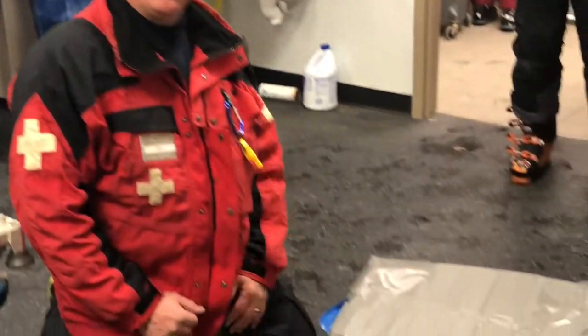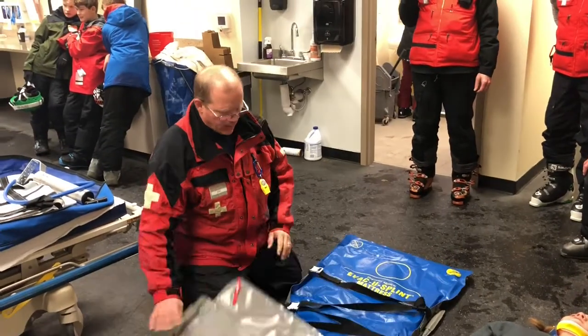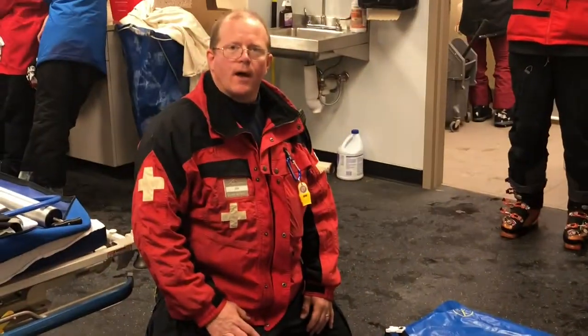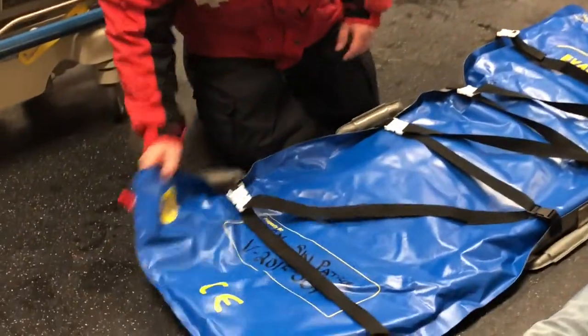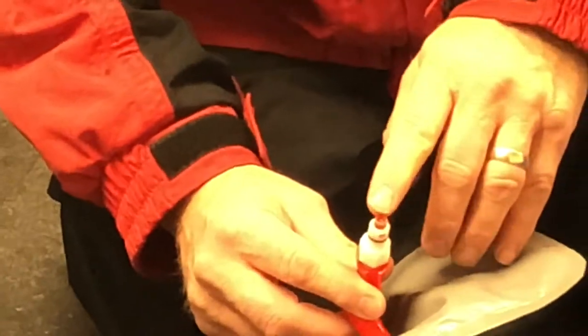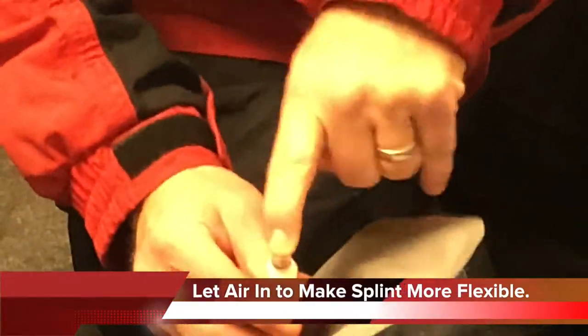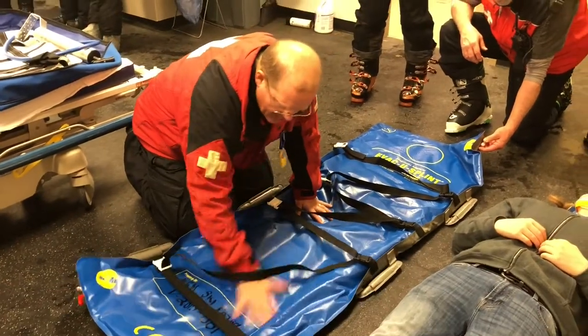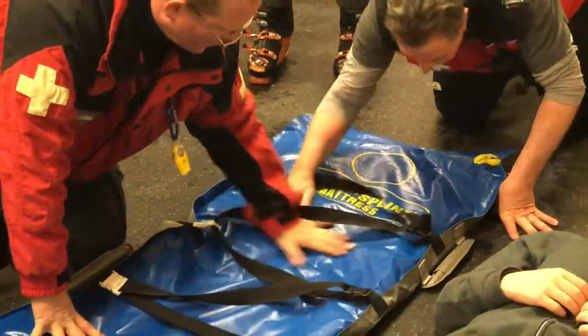We've taken the splint out — it comes folded like this, and we're going to unfold it. Initially it's going to be fairly movable with no stiffness to it. If it's too stiff, there is a valve at the right foot and a valve at the left side of the patient's head. There's a yellow circle icon over each valve to show where it's located. We remove the red cap and depress the red button — that allows air to move into the device, making it flexible. Then quickly smooth it out to get a flat surface.